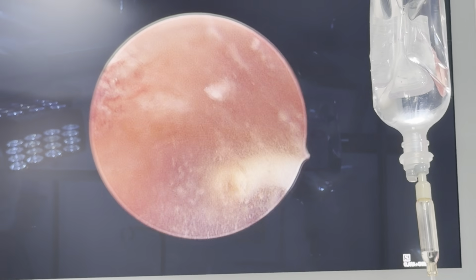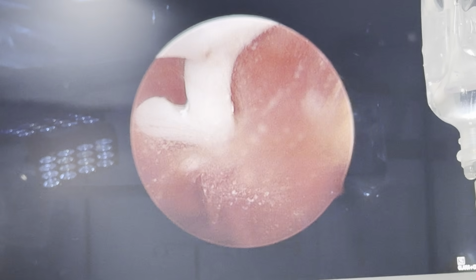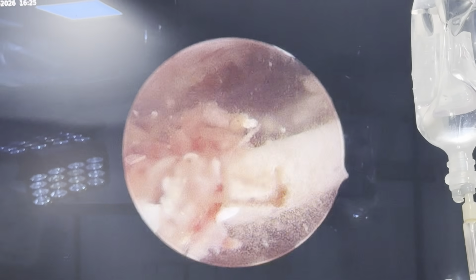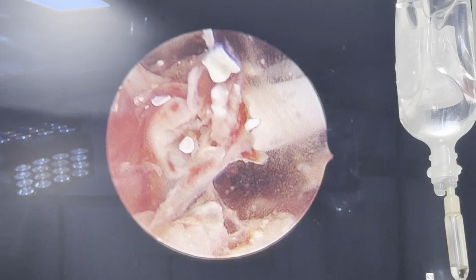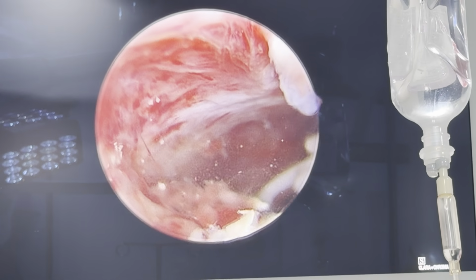A preoperative ultrasound is extremely important in such cases to make sure that the IUCD has not been displaced outside the uterus. As I kept getting a closer look at the cavity, I realized that my first entry was also inside the endometrial cavity just below the IUCD where a lot of blood was collected.